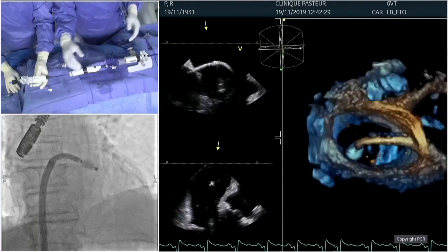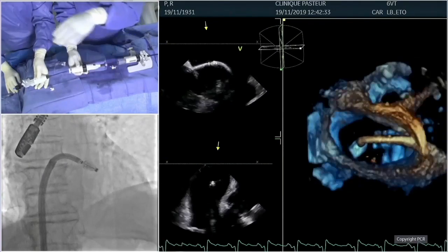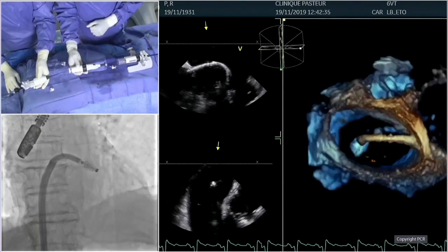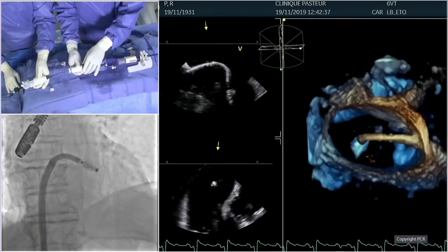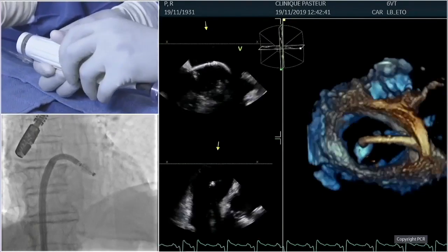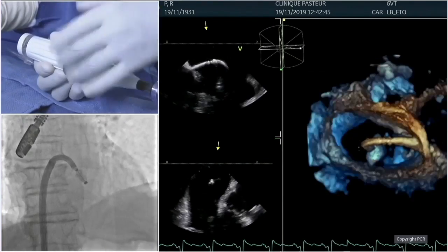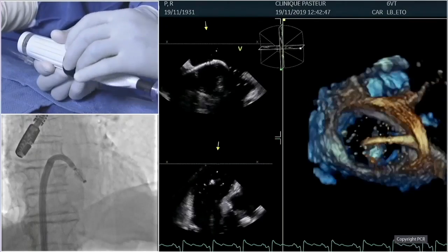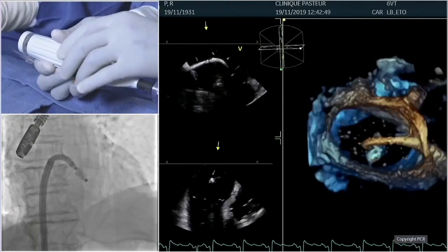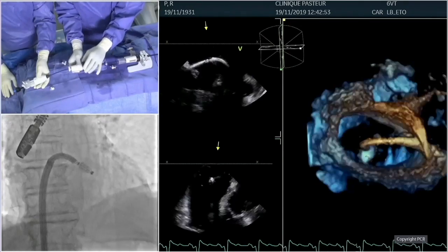Yeah. And so let me demonstrate that. For example, let's say that we are perpendicular to the mitral plane, and I want to be more medial. So what I'm going to do is to flex more the IC. And the IC is going, as you can see, bending towards the medial port. So the trajectory, just to be correct on the term for everybody to understand, the trajectory will dive more medial.